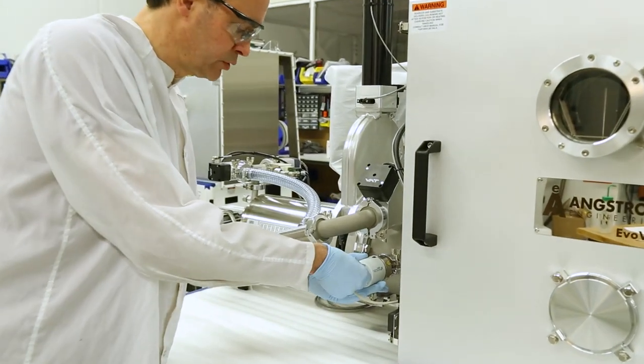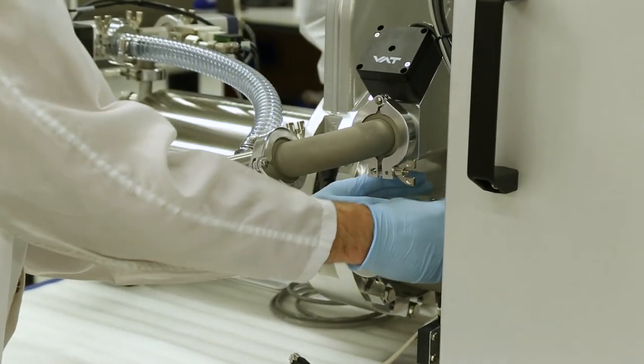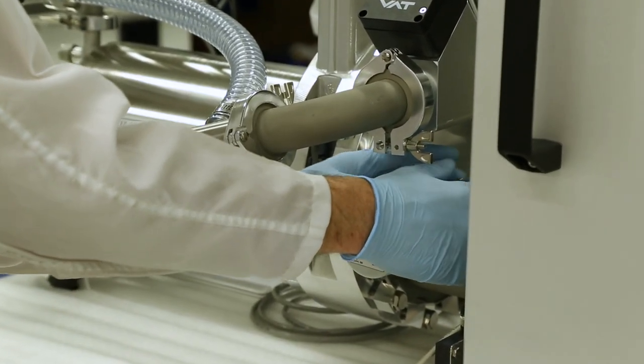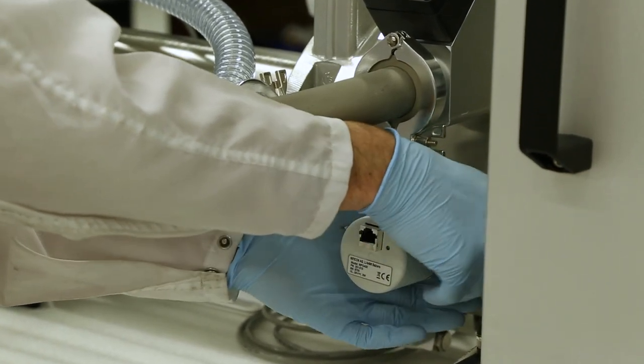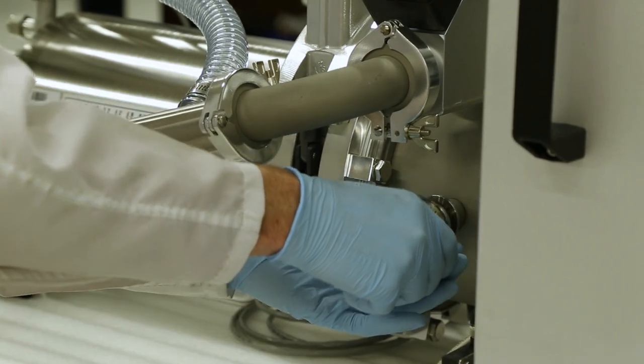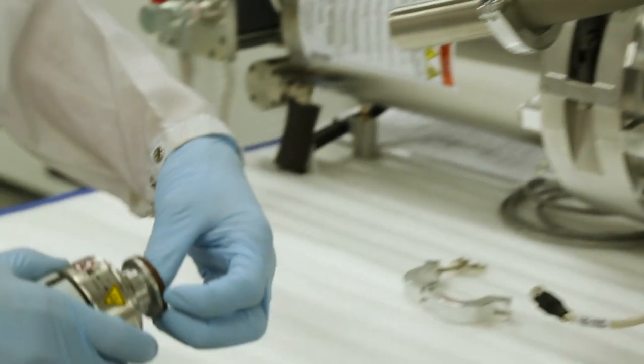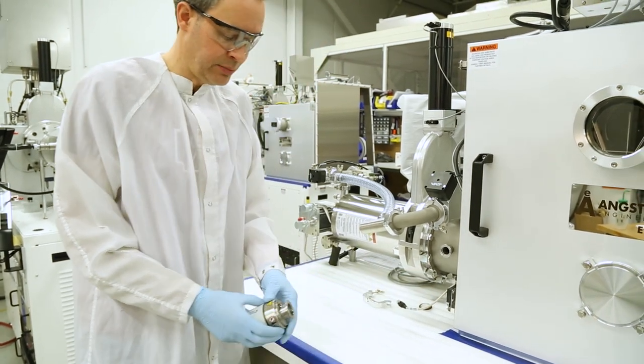To remove the gauge we're going to unplug the communication cable, undo the clamp and remove the gauge from the flange. We'll leave the seal here and take the gauge to the bench to clean.